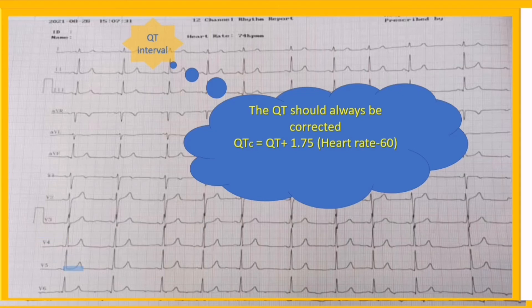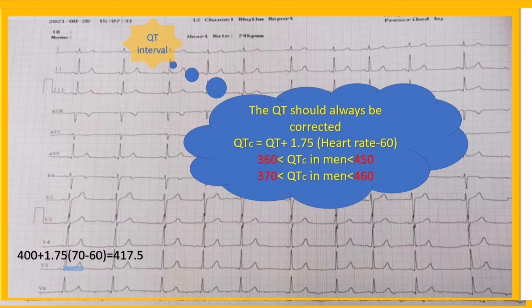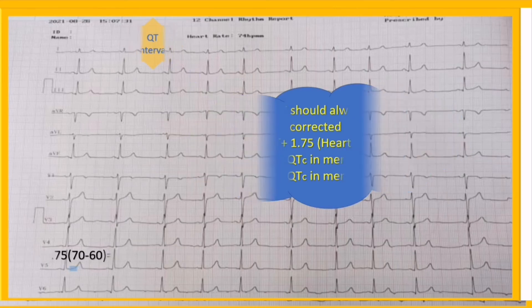We must correct the QT using Hodges formula, and finally the corrected QT of our strip becomes approximately 417.5 milliseconds. Note that the normal range of QT is 360 to 450 milliseconds for men and 370 to 460 milliseconds for women.